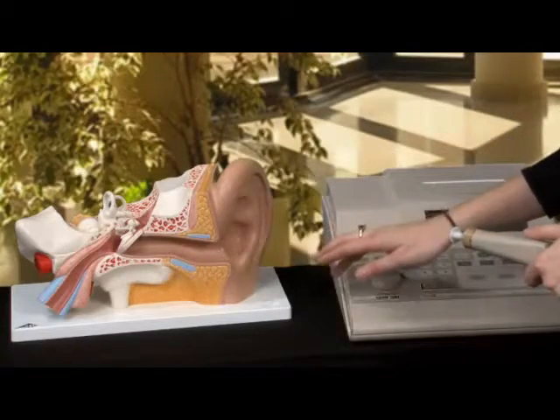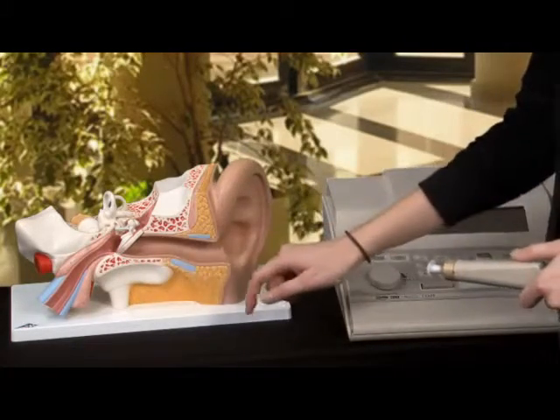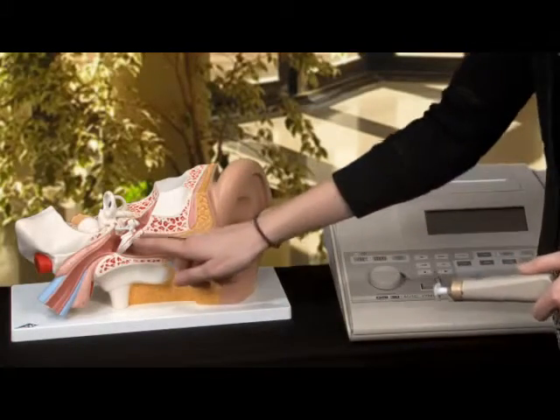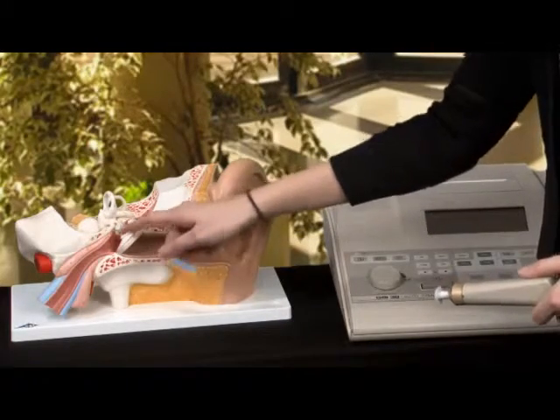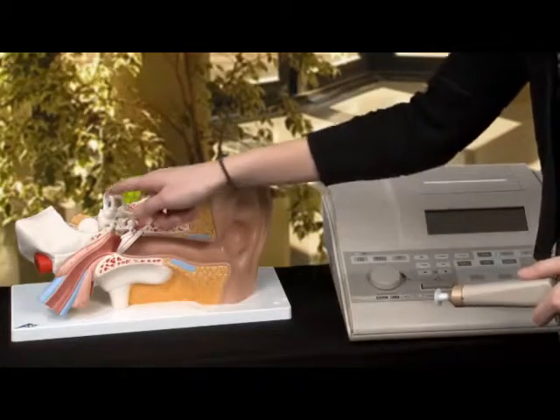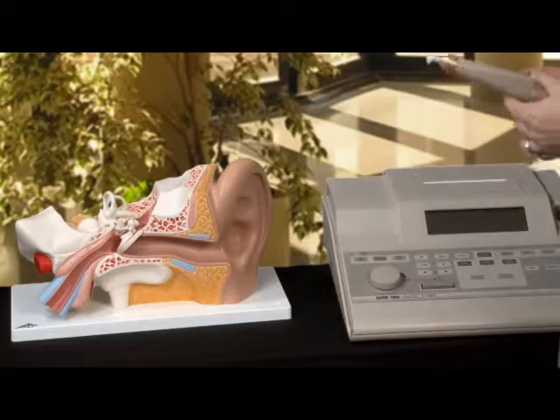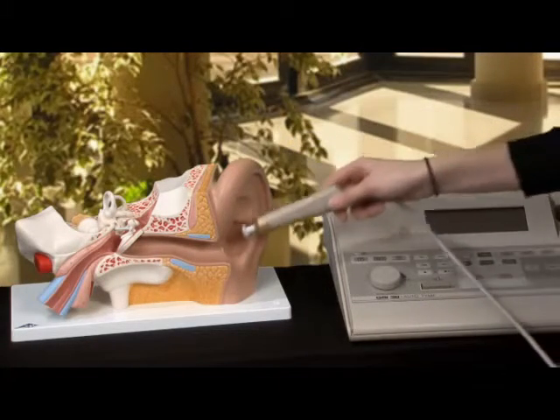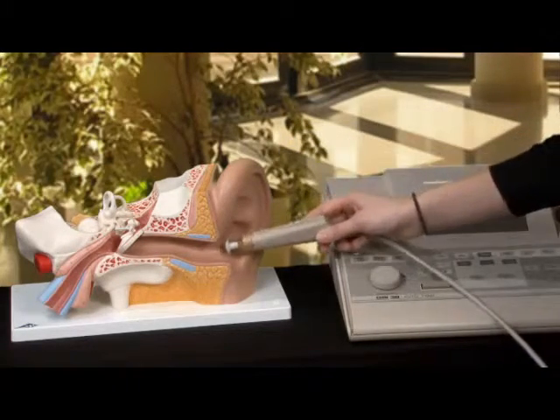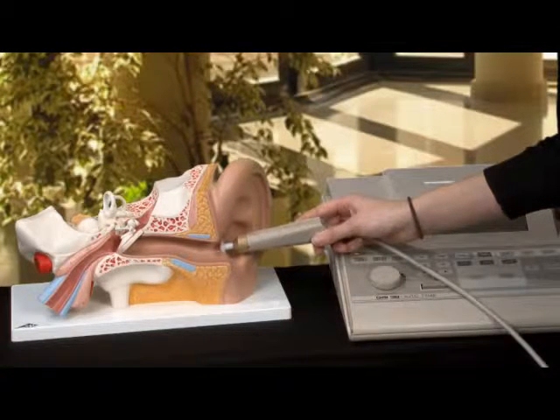Here is a model of the ear. Here's the pinna, the external auditory canal, the tympanic membrane, the middle ear space, and the inner ear. What I'm going to do is place the probe into the opening of the external auditory canal.